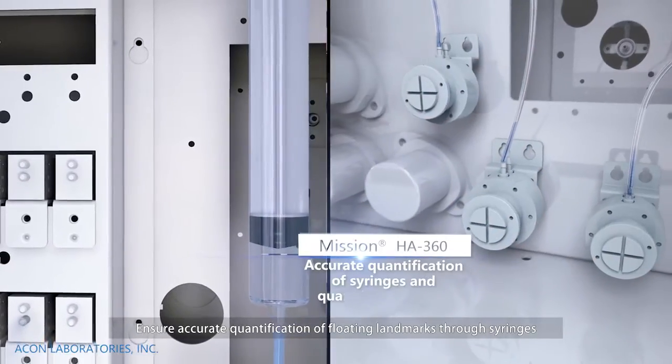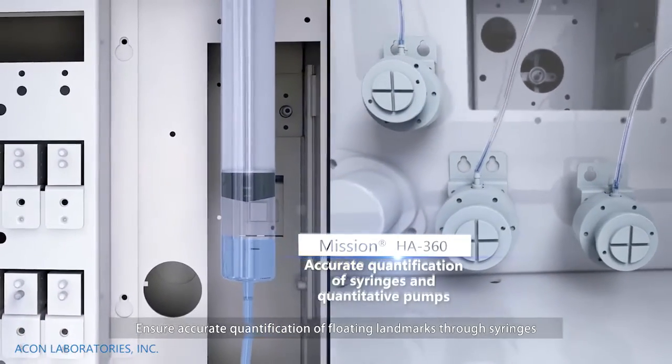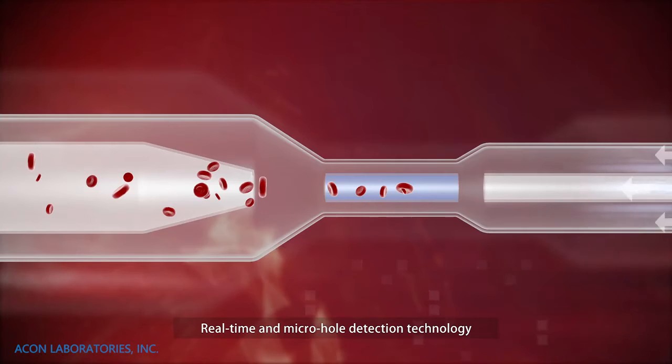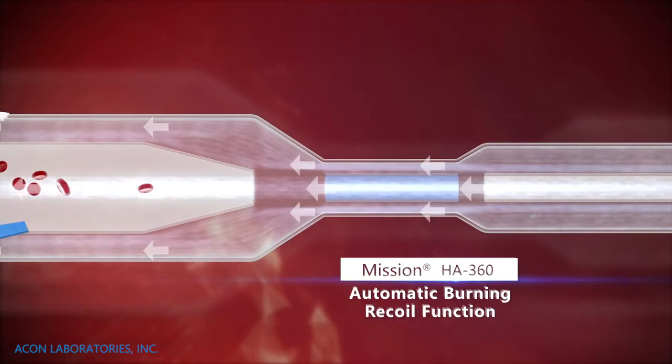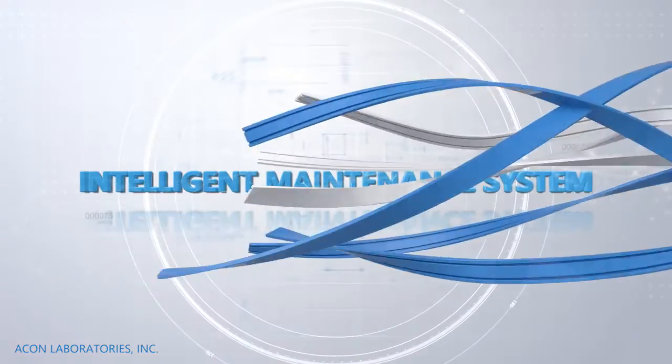Ensures accurate quantification of floating landmarks through syringes and metering pumps. Real-time micro-hole detection technology. Automatic burning and recoil function.